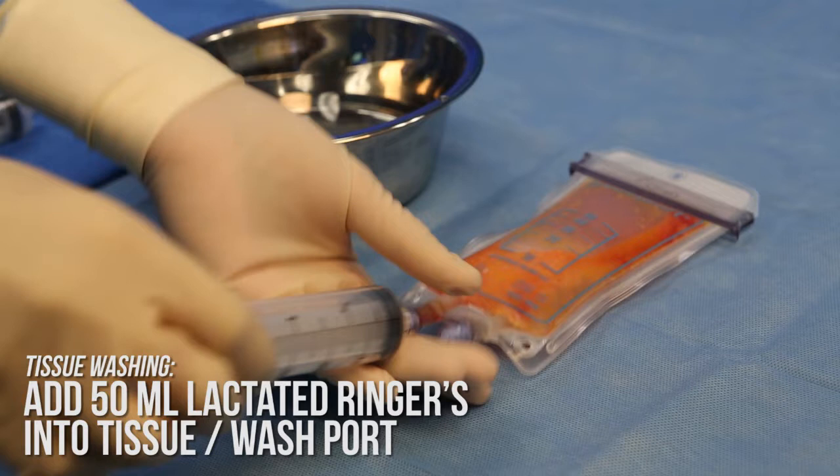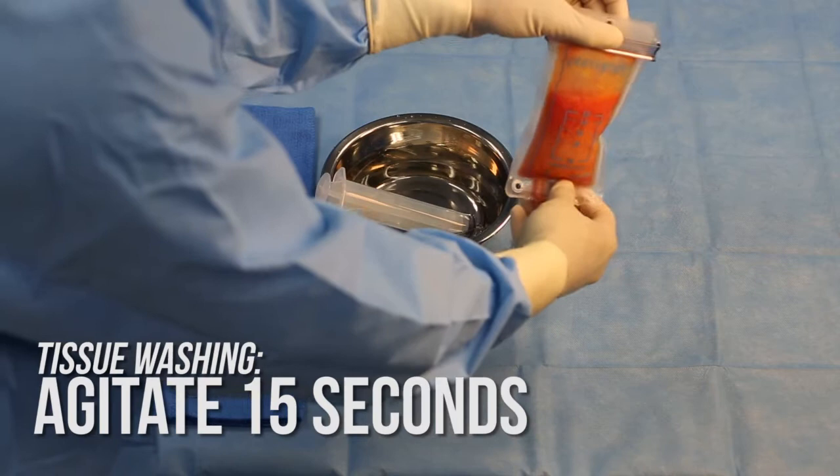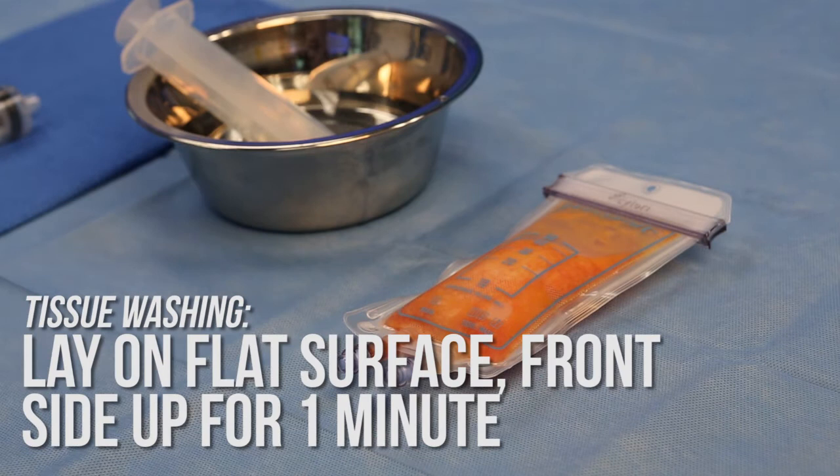Once the lactated ringers is added, manually agitate the PureGraft 50 system by rocking it back and forth for 15 seconds. After it has been thoroughly mixed, place the PureGraft 50 system on a flat surface, front side up, for a minimum of one minute to allow contents to separate. The horizontal position allows a larger surface area of the meshing side to be in contact with the tissue.